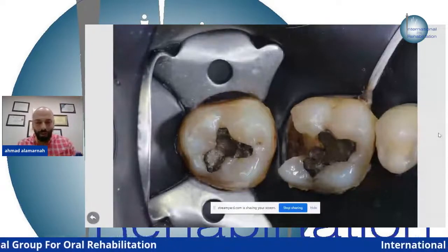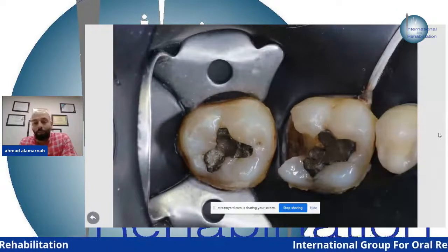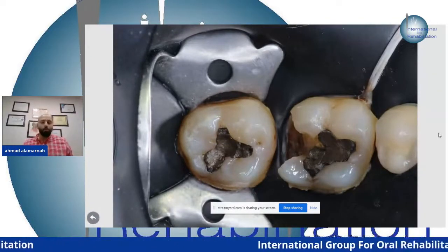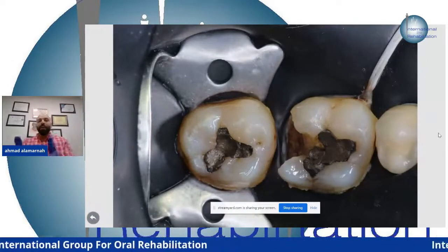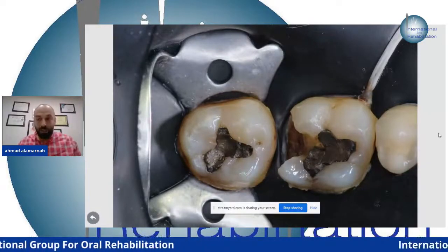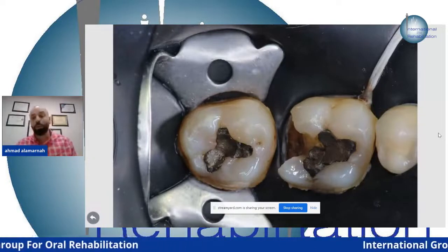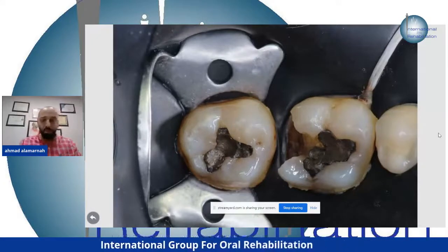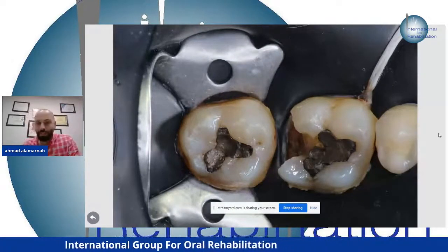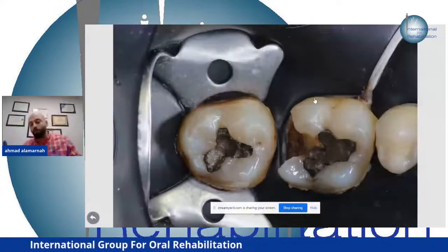I always isolate the 6, 7, and 5. When you use the rubber dam, always isolate the tooth before and the tooth after, because you need a wide field for working and you don't know if there's a defect in the adjacent tooth. If you isolate only the 6, you won't be able to re-establish contact between the 5 and 7. In this picture, I use floss on the 6 — you can see it — which helps envelope the rubber dam inside the sulcus and expose more tooth structure.